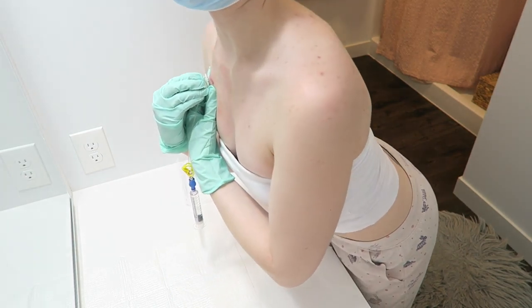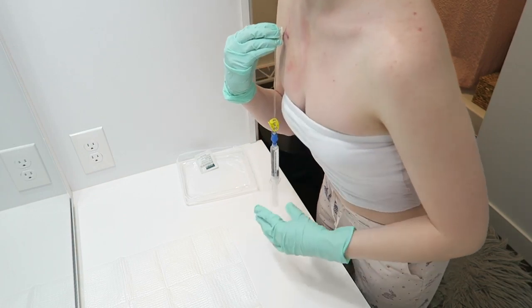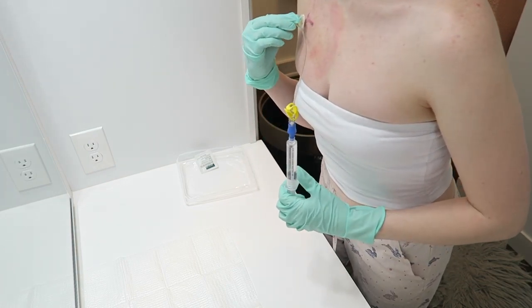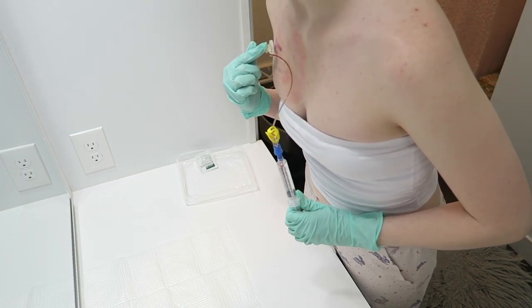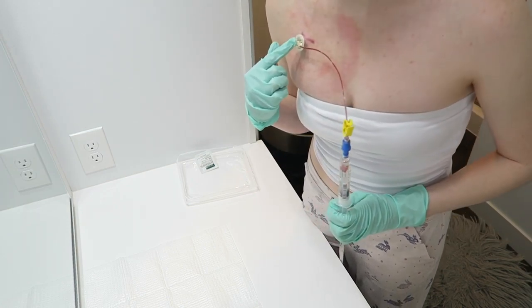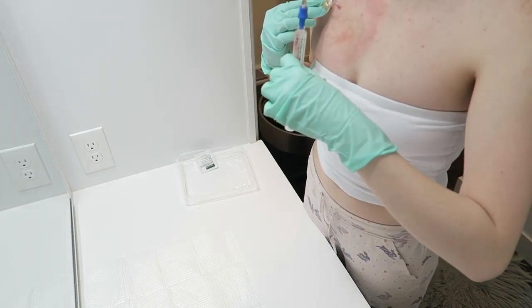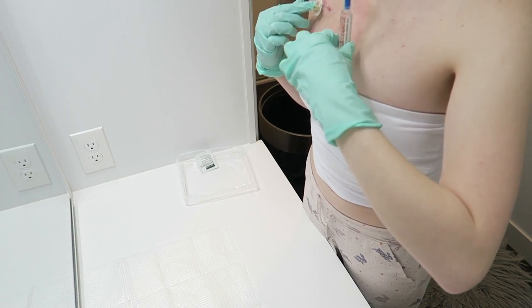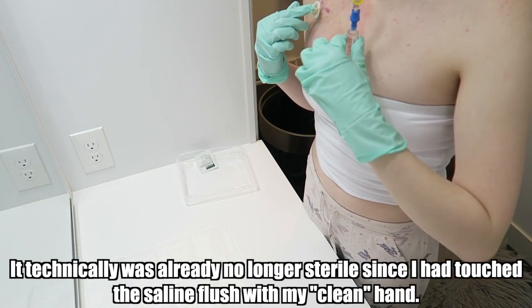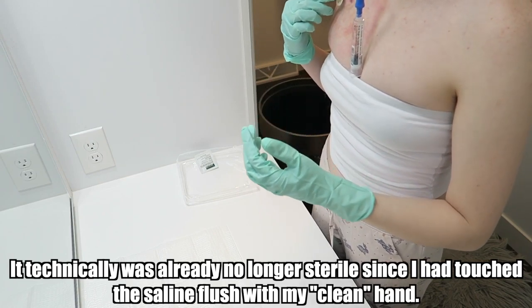So now I've pushed the needle all the way in. I'm gonna take my left hand and I am going to pull back and check for blood return. As you can see, I have blood return. So now I am going to go ahead. Now, because I don't have a nurse or anyone to help me, I'm going to stick the syringe into my shirt. Technically, this is now no longer sterile, but that's okay.